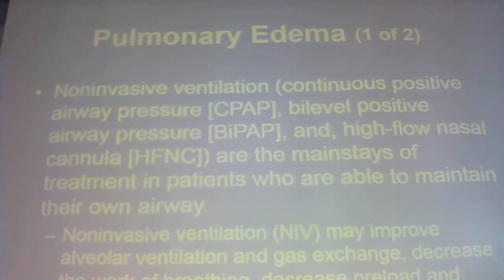It's for people who can't take the whole mask. She was on it all the time. I think they're using them in hospitals on BiPAP patients when they have to eat their meals too. We'll switch them over to the cannula so they can actually put food in their mouth. And a lot of your neonates and infants that are on CPAP in the NICU, they're on nasal CPAP. Why? Because they're obligate nose breathers, right?